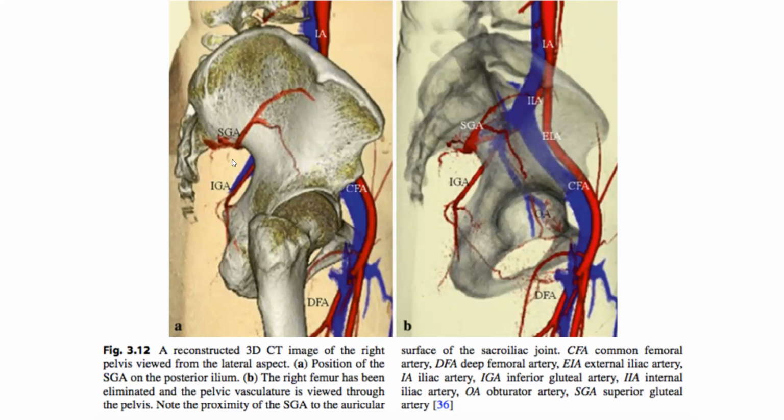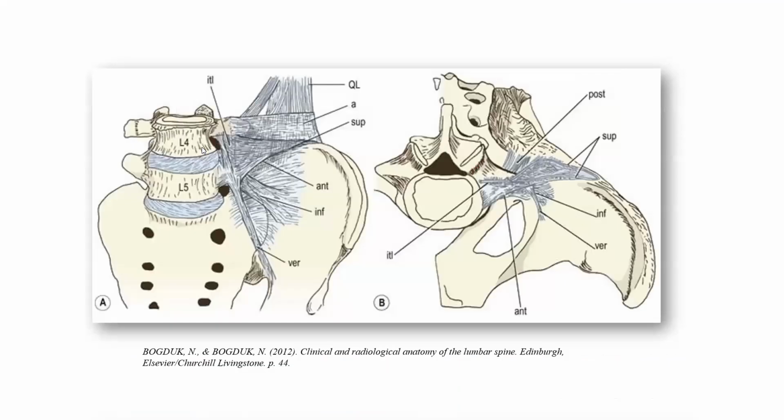The superior gluteal artery, nerve, and vein are in the notch, but they're much lower compared to the access point up in this region. And all anatomy for the lateral devices has to be considered, including this vessel, which is less of an issue when you're performing the posterior inferior approach. Again, the very robust neurovascular structures anteriorly need to be avoided as well.